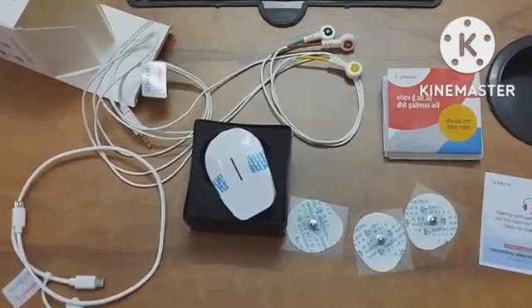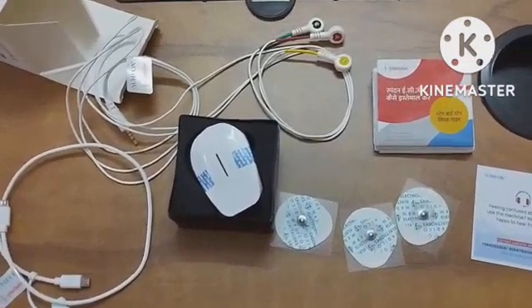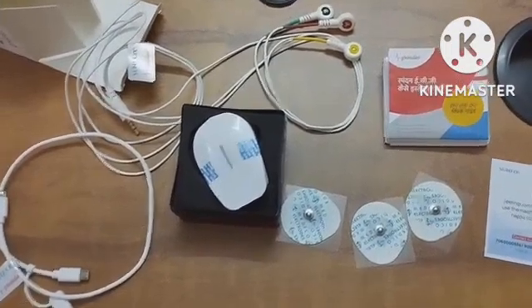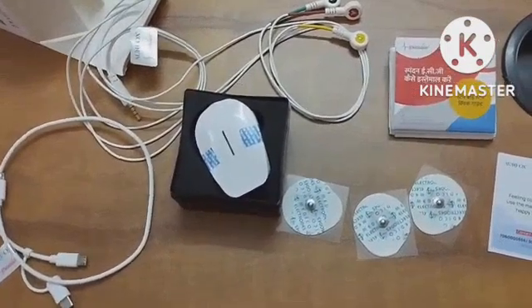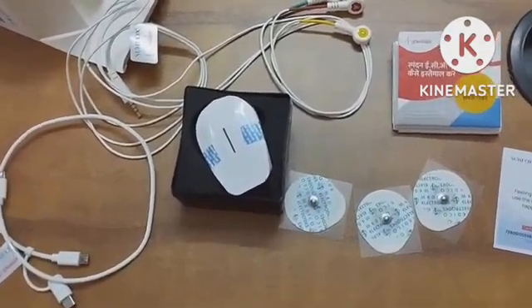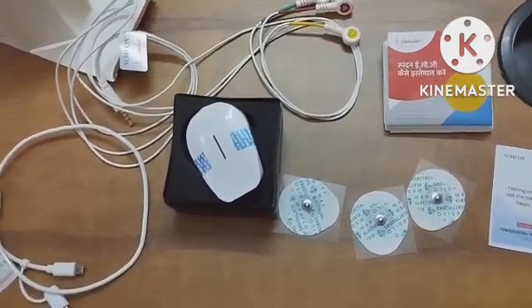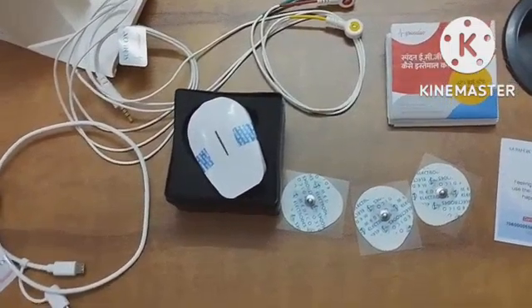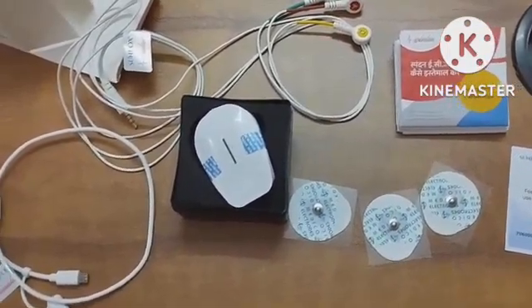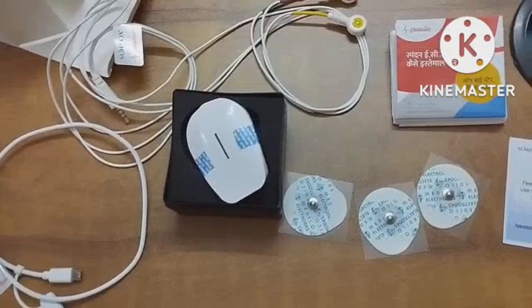Now let us talk about some of the advantages and disadvantages of this device. The first advantage is that the device is very small and you can carry it even in your pocket. It is cheaper than the conventional ECG machine, easy to operate, and can be used with a mobile. You can get a print of the ECG as well as an interpretation. You can get 7-lead ECG or 12-lead ECG with the help of this device.